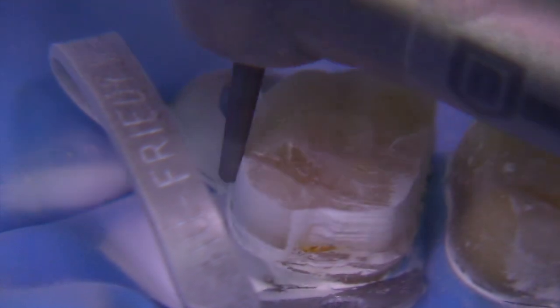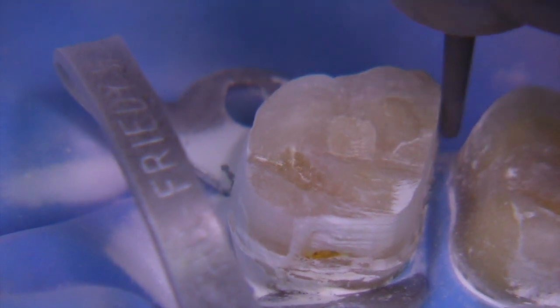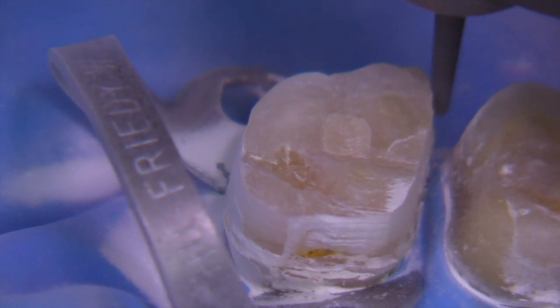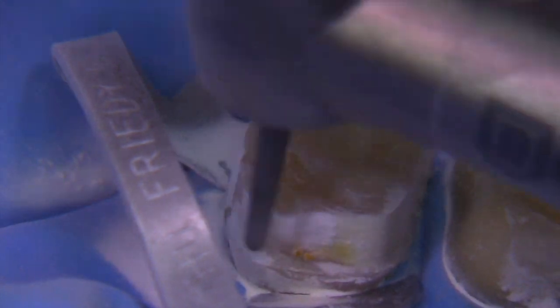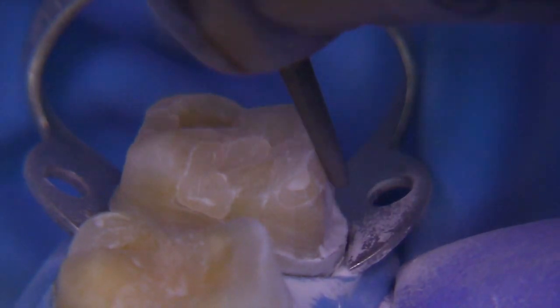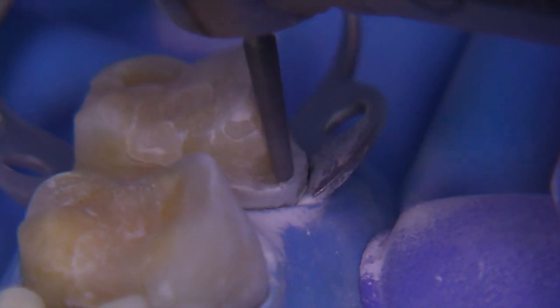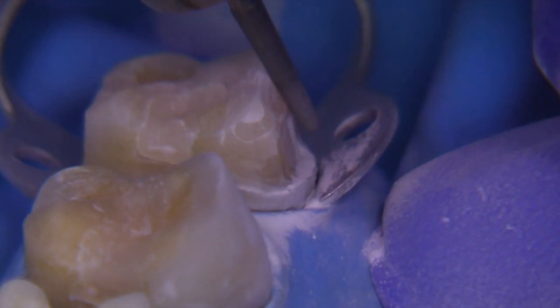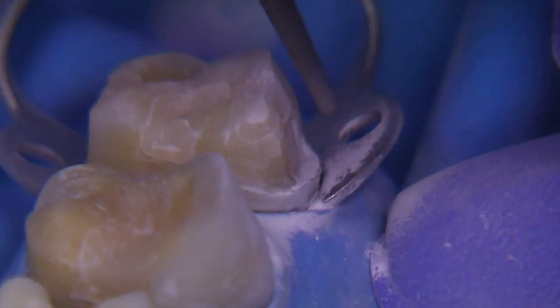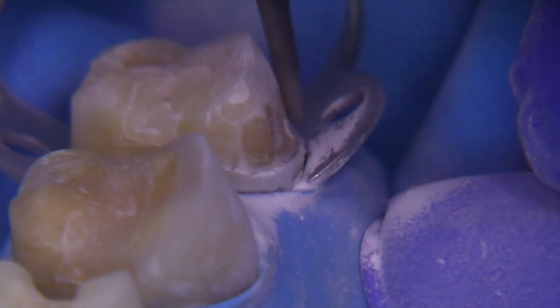This is not a chamfer. This is not a shoulder. We use the term chamfer inappropriately — a chamfer is a bevel. A chamfer has a declination angle relative to the axial wall of at least 45 degrees, sometimes 60 or 65 degrees. Notice the secondary plane that we place on the facial — we place one on the lingual as well — and this is not the functional cusp bevel. This is just a secondary plane to follow the contours of that adjacent tooth to create a little bit more uniformity in the ceramics.